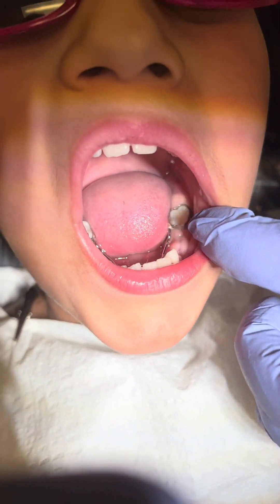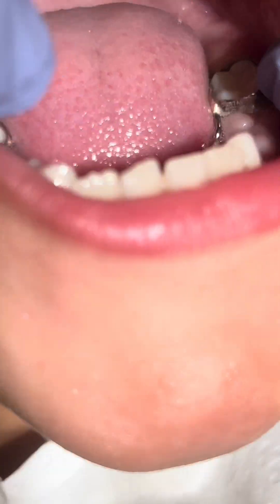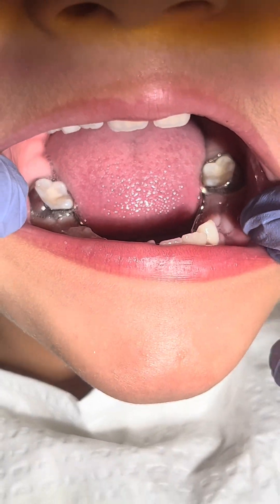This appliance is generally not used until after the mandibular permanent incisors have erupted.